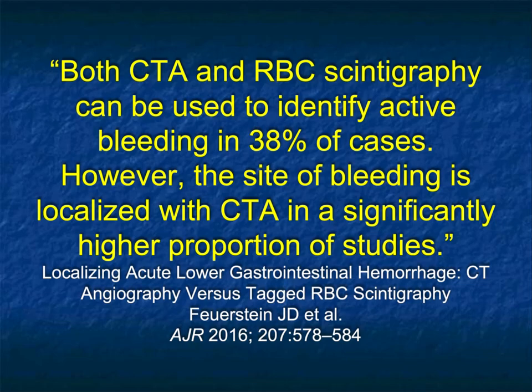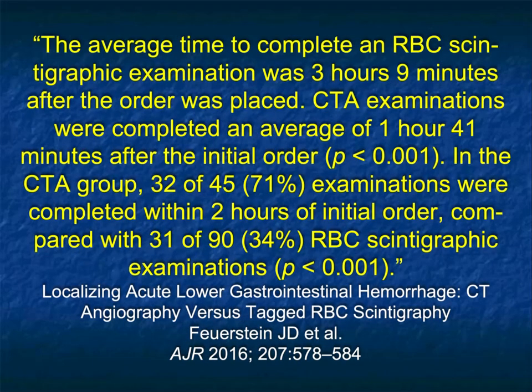Now, this article goes back to 2016. The cases were from 2010. So, again, the numbers are not perfect. However, they did say the site of bleeding is localized with CTA in a significantly higher proportion of studies. And again, that becomes very important to us as we determine how to manage the patient.